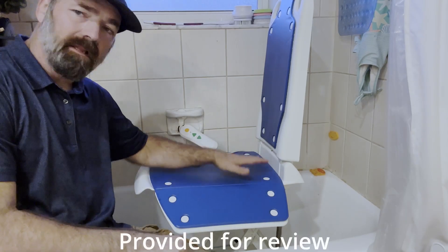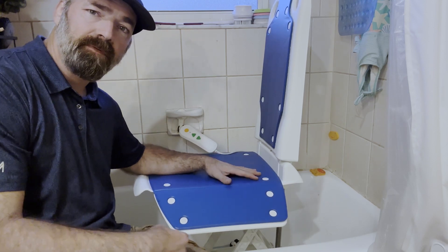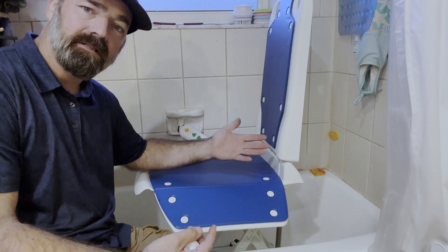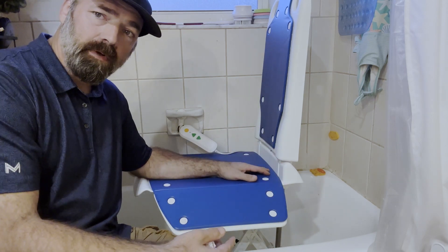Today I'm going to be showing you this lift chair. This is a waterproof lift chair for elderly people, or if you've had surgery, or if you have a disability or an illness and you have a hard time getting in and out of the tub — or even getting up and down off the floor, you can use it for that as well.